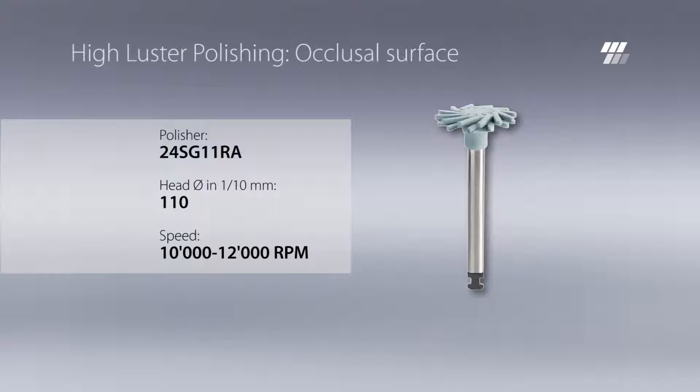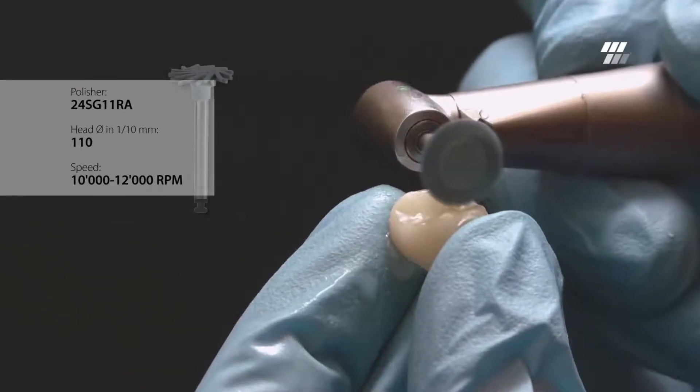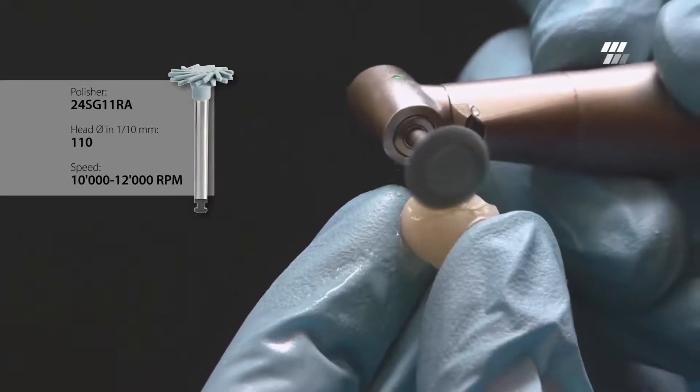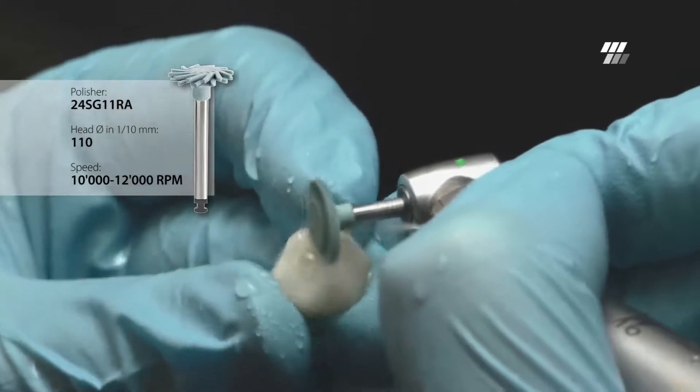For high luster polishing of the composite, use Diatek ShapeGuard Comprashine Plus. Comparable to the first step, polish the occlusal surface, fissures and cusp slopes with the head diameter of 11 mm.